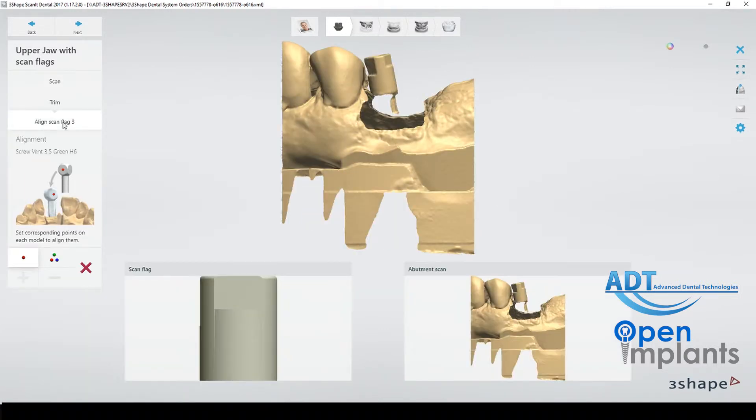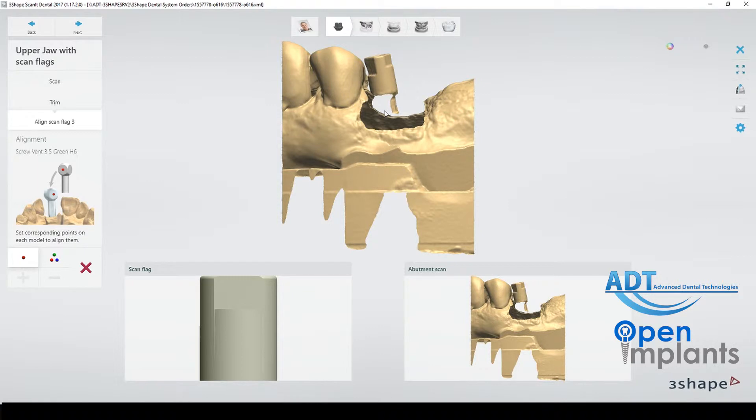After the first scan you notice you can only see the top but not the metal base. This is perfectly fine. As long as it is properly seated and the top is clear that is all that's needed for the system to know the location. And again the metal interface is great for durability and visibility in the x-ray.